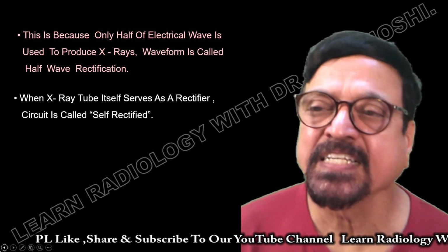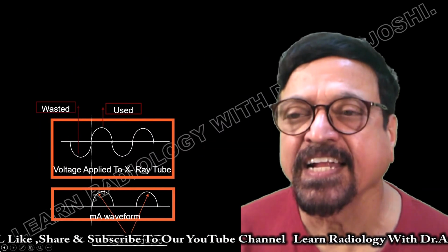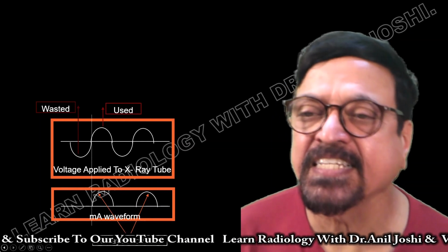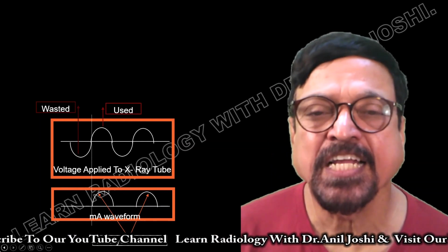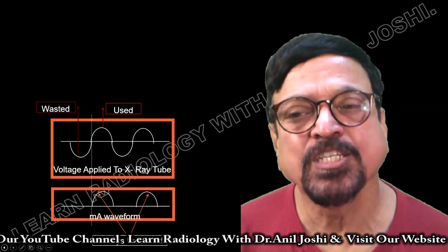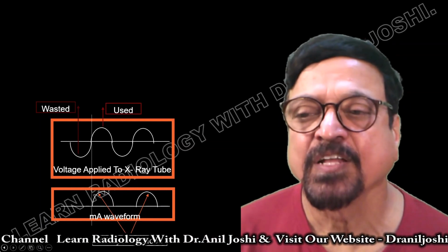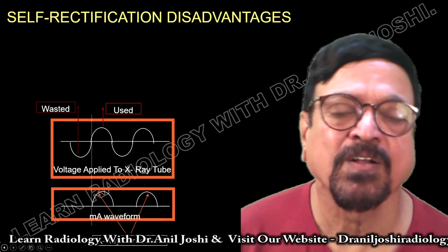When the X-ray tube itself serves as a rectifier, the circuit is called a self-rectifier. Here we are seeing which are useful, those which are upstrokes, and which are wasted, those which are downstrokes. So they are producing only 50% efficiency, and the other 50% is just producing heat and wear and tear. So this type of X-ray tube will not be viable or long standing.